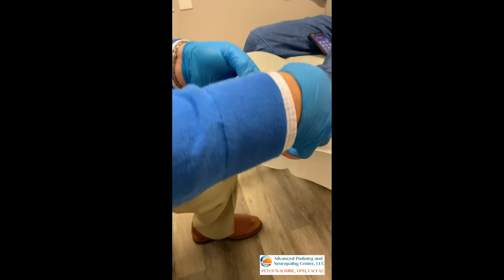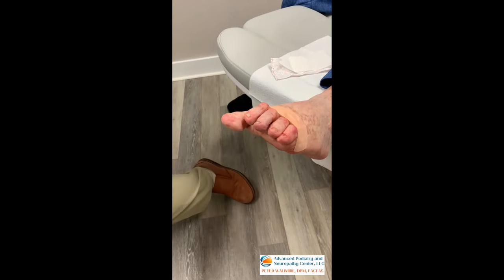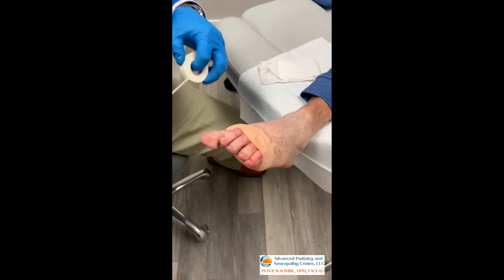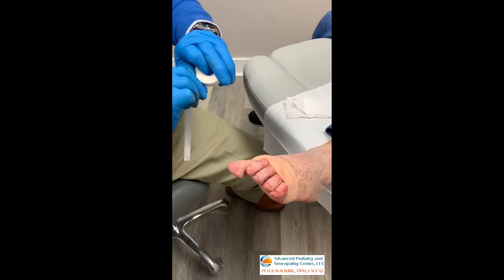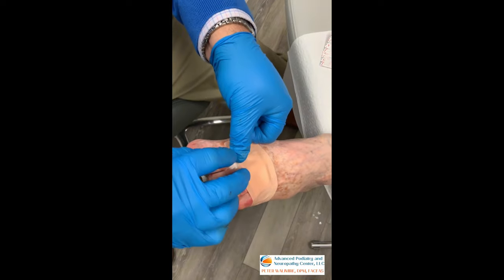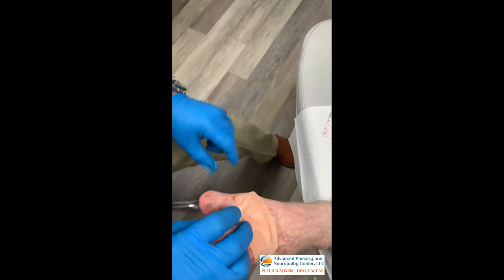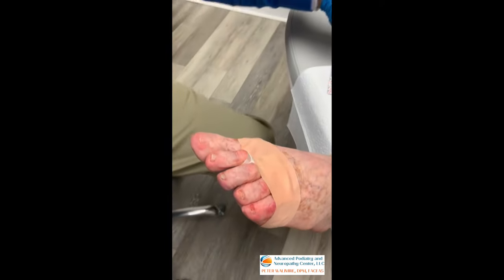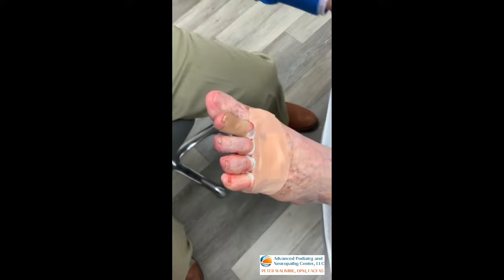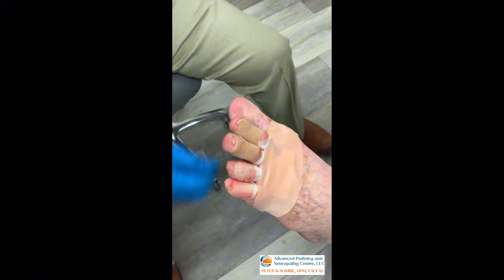We're going to cover up the incision sites with one big band-aid. Step number two is to utilize the tape and pull these toes down. We're going to get a strip of tape about eight inches long and do like a breast cancer awareness ribbon around the toe — pull that down from both sides, apply downward pressure, and keep those tendons from scarring down. We're going to put a band-aid around the knuckle where we release the toe, which will hold the toe nice and straight. You can see how much improvement we already have.